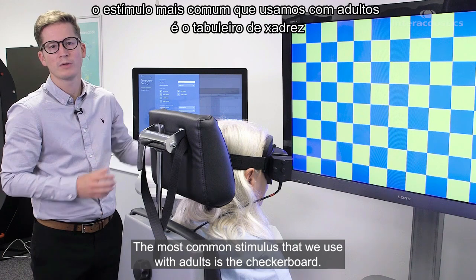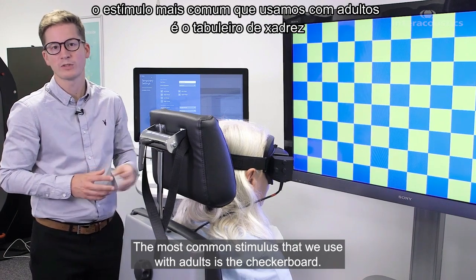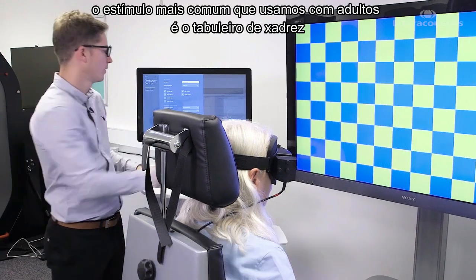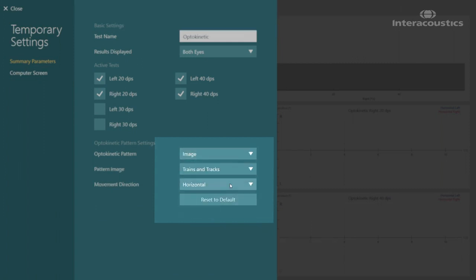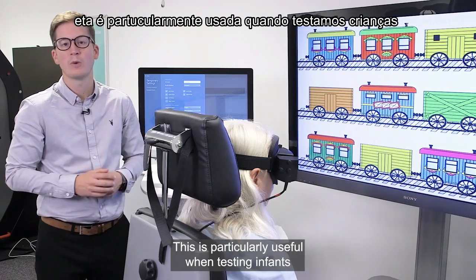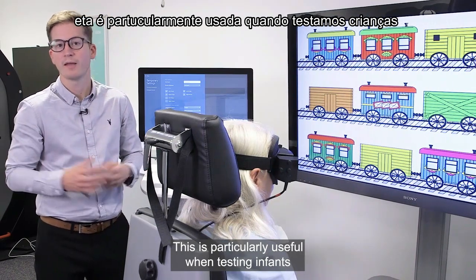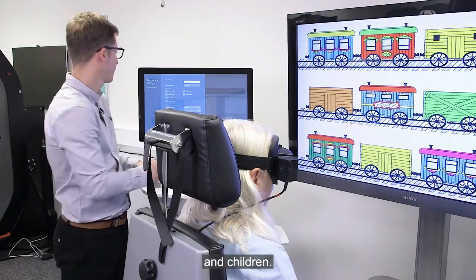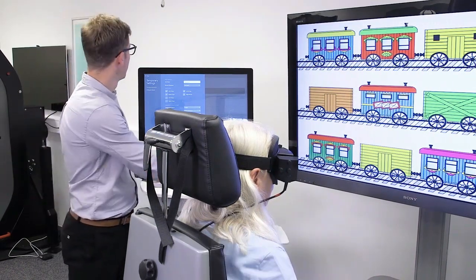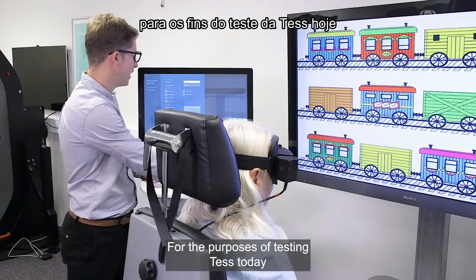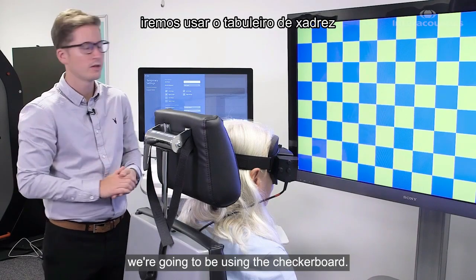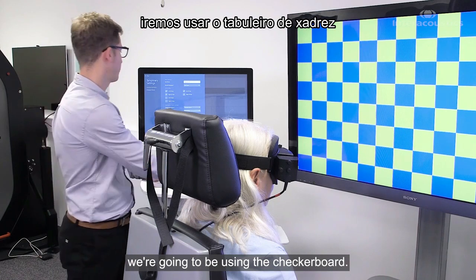The most common stimulus we use with adults is the checkerboard. However, to make things a little bit more interesting, we can also change these to images. This is particularly useful when testing infants and children. For the purposes of today's testing, we're going to be using the checkerboard.